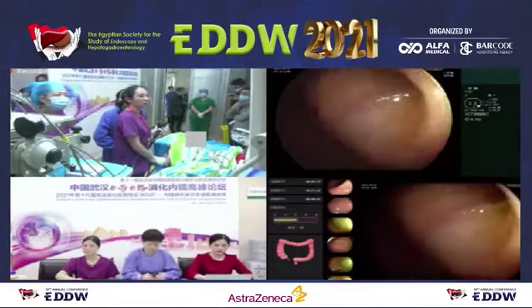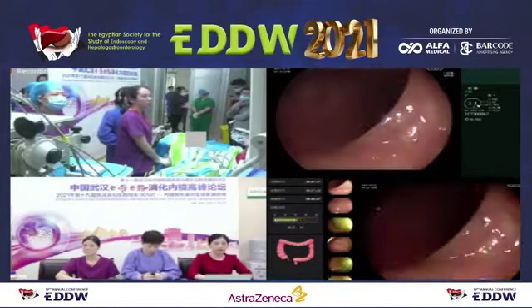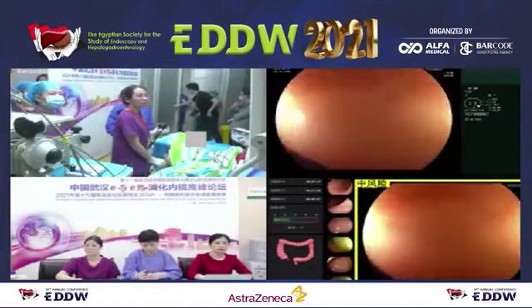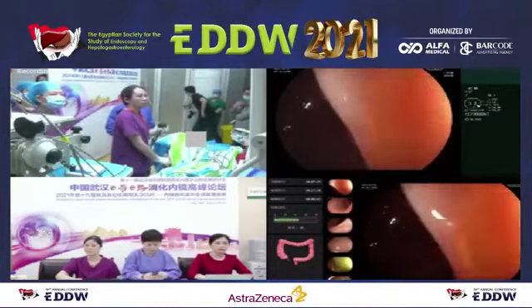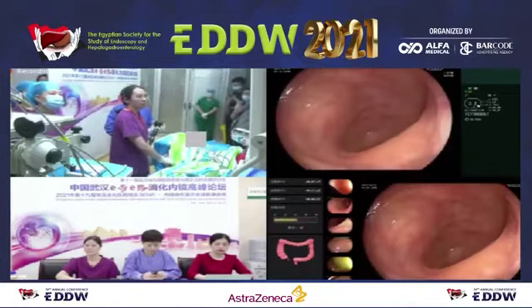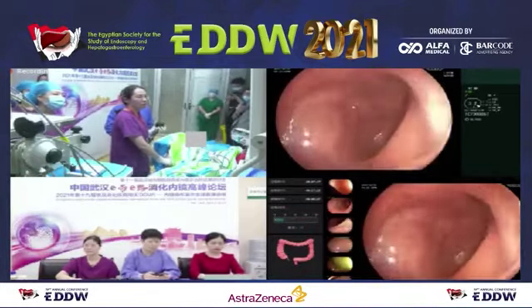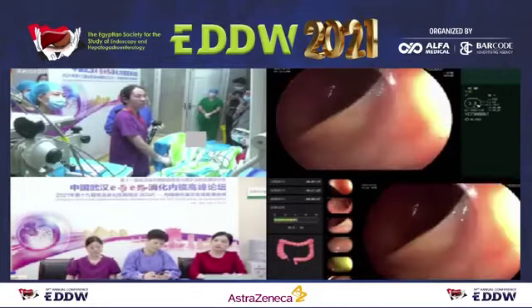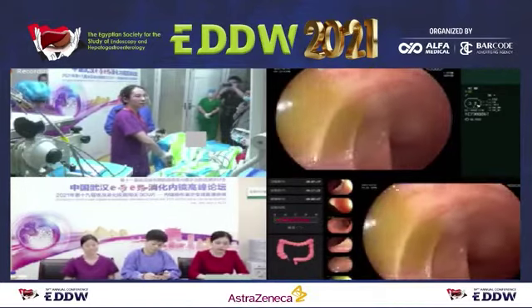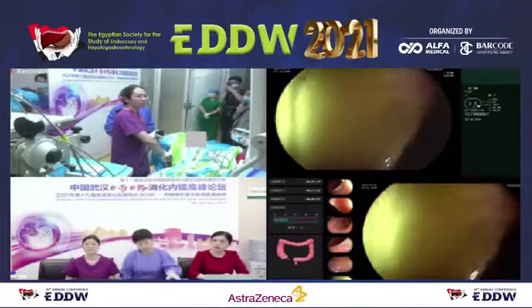It's not too fast. As in the guidelines, we need to make sure the pullback time is no less than 8 minutes.